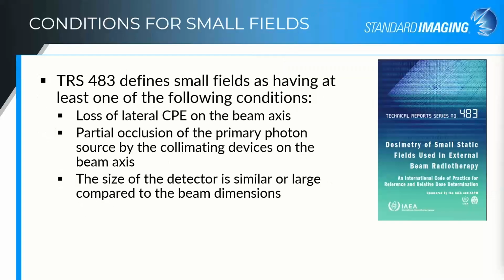So if we're talking about small fields, the place that I'd like to start is the definition. What is a small field? What are we really talking about here?